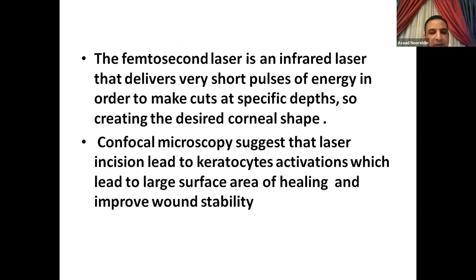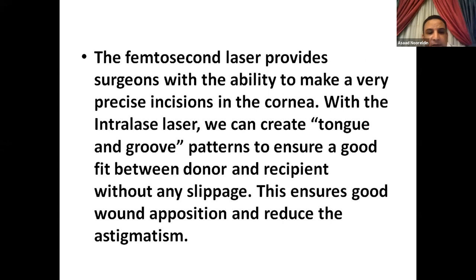We can make cuts at specific depths with the femto laser, and confocal microscopy suggests that laser incision leads to keratocyte activation, which leads to a large surface area of healing and improved wound stability. With the femtosecond laser, the surgeon has the ability to make a precise incision of the cornea. With the femtosecond laser, we can create a tongue and groove pattern to ensure good fitting and coaptation between the donor and the recipient without any slippage. This ensures good wound apposition and reduces astigmatism.